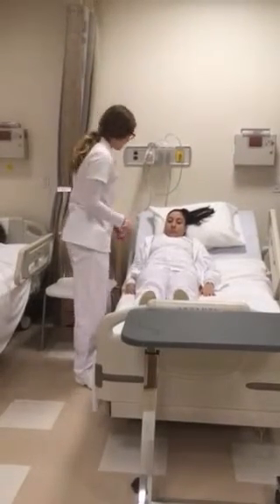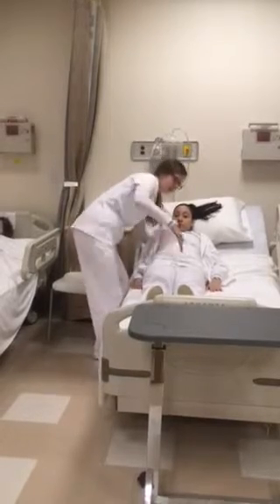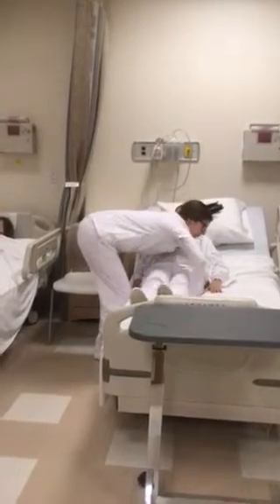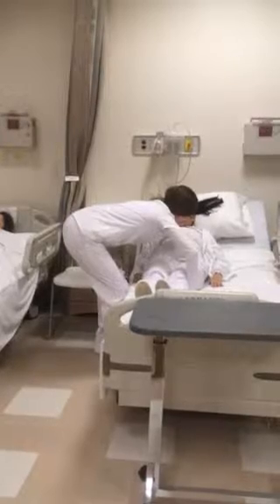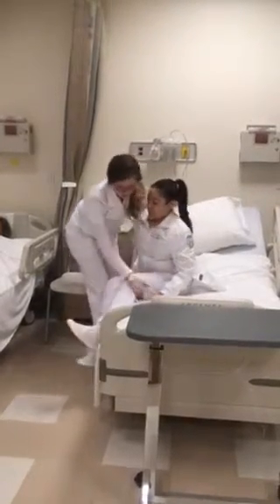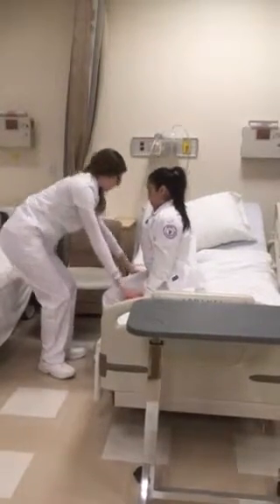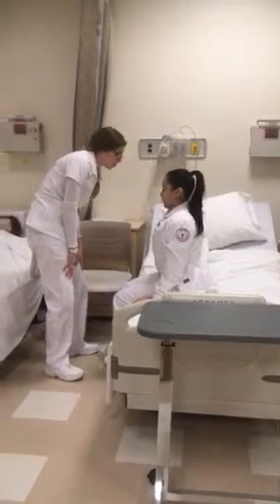Alright, perfect. So the next thing that you want to do is you're going to want to assist them upward and over to the side, right? So you're going to feel my hand behind your back, okay? And you're going to feel my other hand go right underneath your knees, okay? And on the count of 3, we're going to pivot you over to the side, okay? 1, 2, 3. Alright, perfect. If you could just fix yourself up. Alright, can you place your hands onto the bed? Okay, perfect. How are you feeling? Do you feel dizzy, lightheaded?